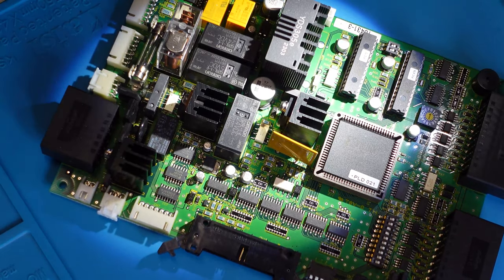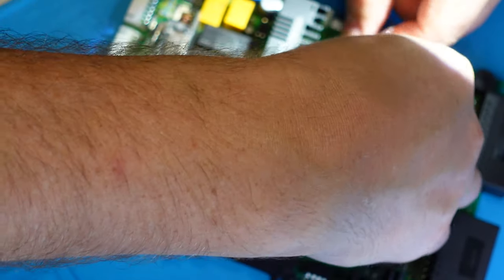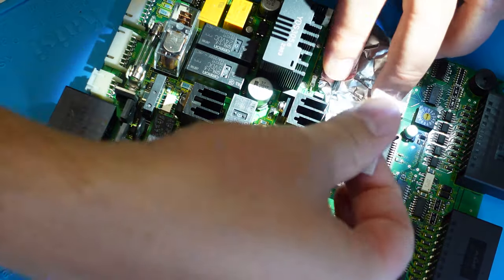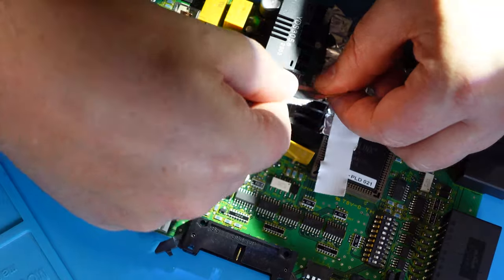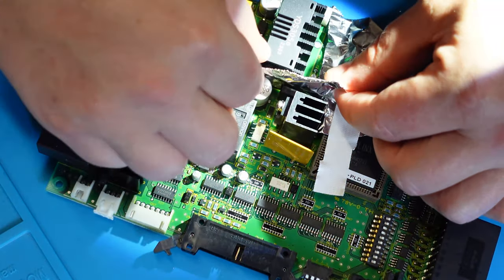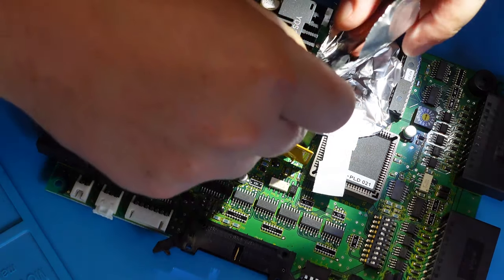Okay, I'm going to put that down for a moment. Now I have to pull some of this off and put it over the areas of concern. This one here, I'm going to go around some of these components, all the way down to the board. Here are some pieces of tape to help secure it. Excellent. I know it's going to be difficult to show you on camera all that I'm doing, but all I'm doing is masking some areas to shield them from the intense heat that I'm going to inject into the area.